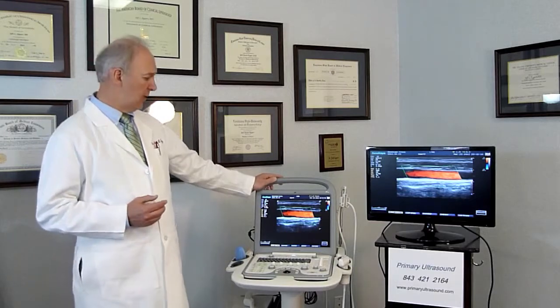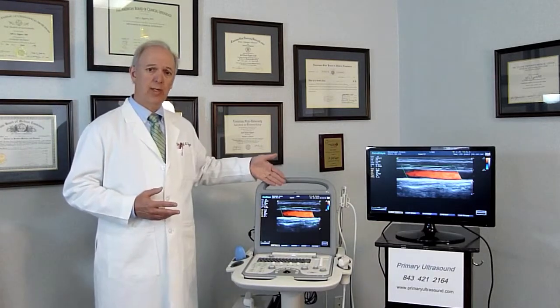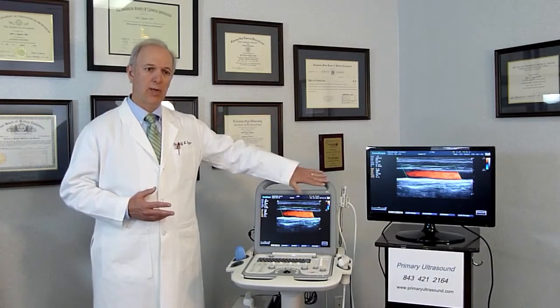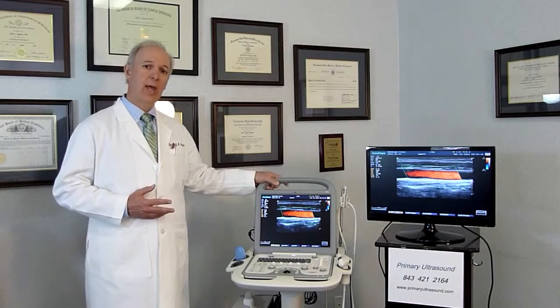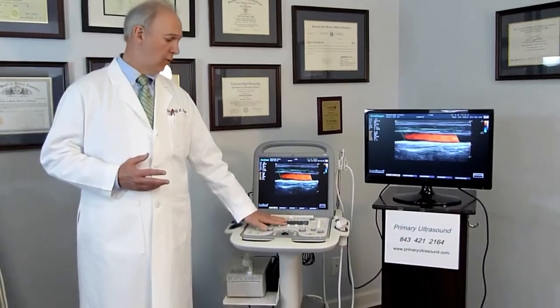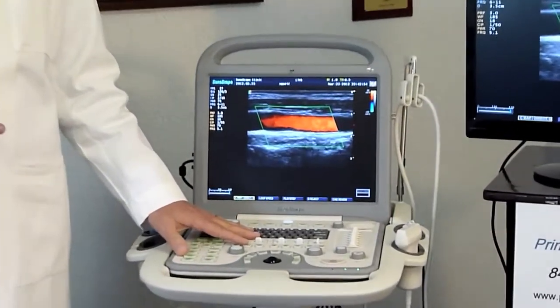Some of the particular features of this ultrasound: it has a 15-inch screen, and you can see how the picture virtually fills the screen. It also has an adjustment so that you can tilt the screen. It has a good keyboard with large keys, and it can take two transducers simultaneously.